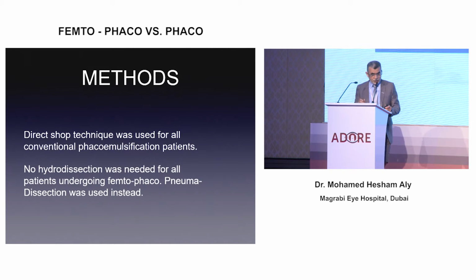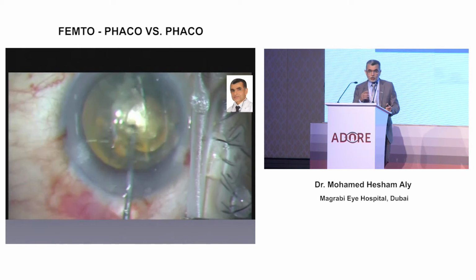No hydrodissection was needed actually in the femtophaco, which we presented as well in these videos; we called it the magic bubble.